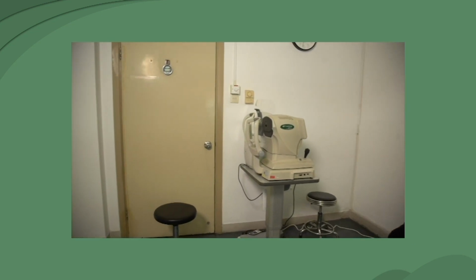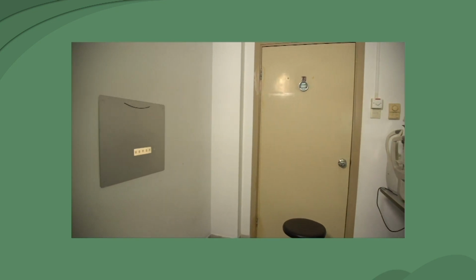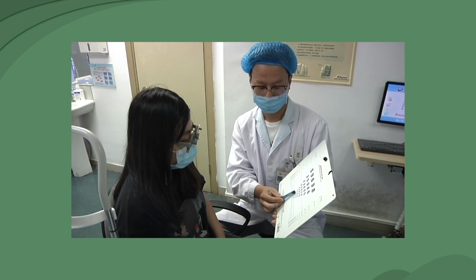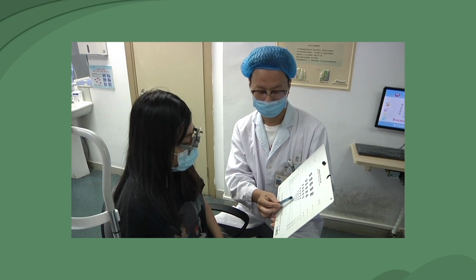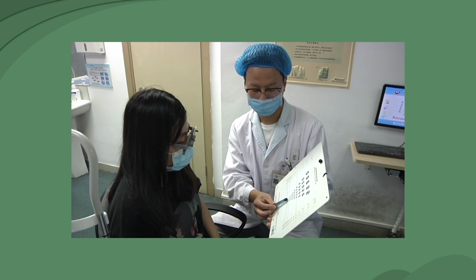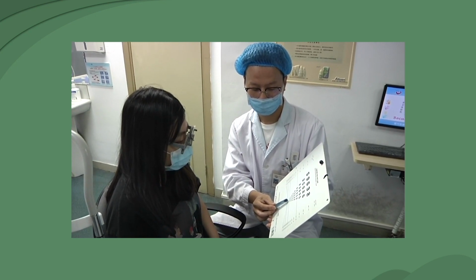Visual acuity is usually measured using the chart at 5 to 6 meters, but near vision is also important for many activities in life, such as reading, and using cell phones and computers. For near objects producing divergent rays of light, the normal eye can increase the refractive power by accommodation to get them in focus. But with age, the accommodative ability decreases, which is called presbyopia. Examining acuity of near vision and the lens needed for correction would benefit the elderly.